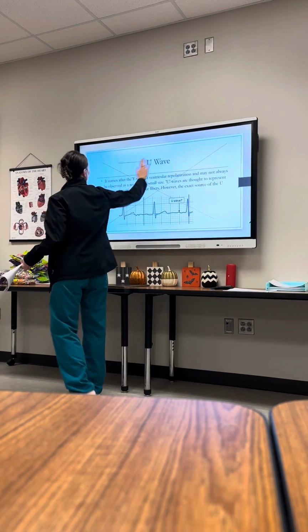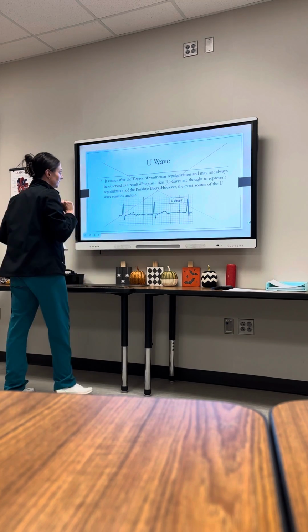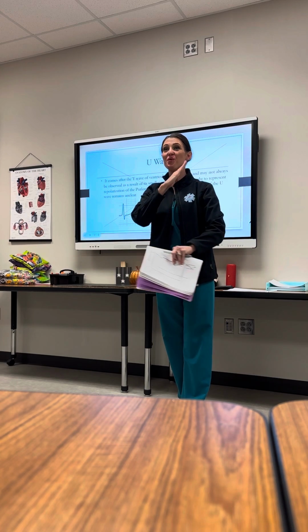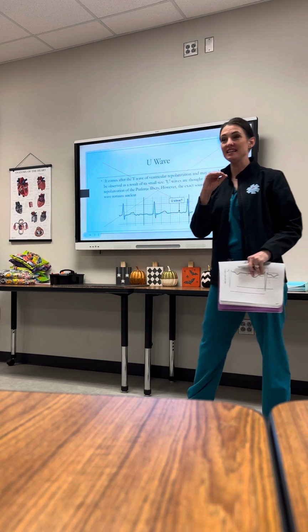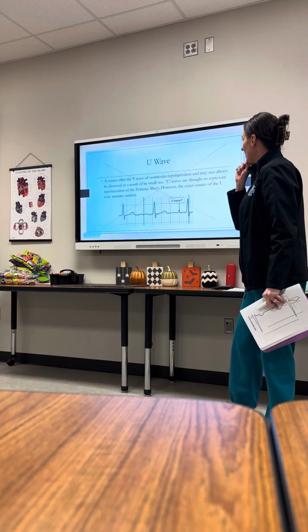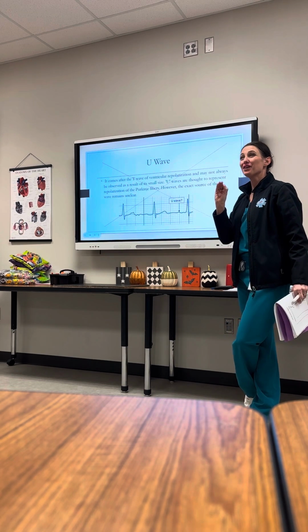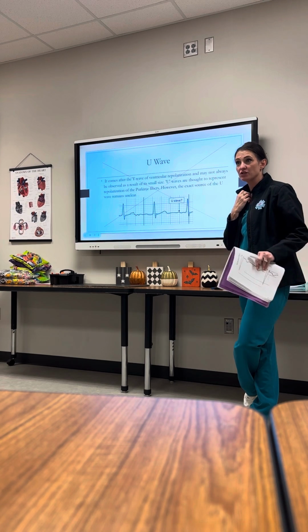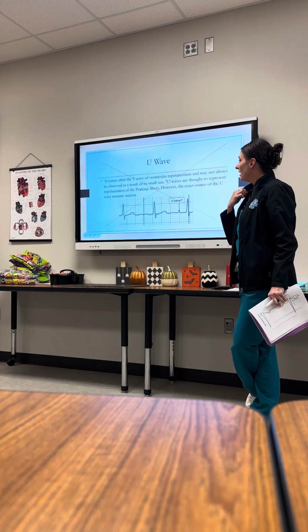Okay, yay, U wave. Ooh. All right, there is a big X on this slide because it's so rare that you were going to see a U wave. We may have a question about it on a certification exam, so that's why we like to talk about it.